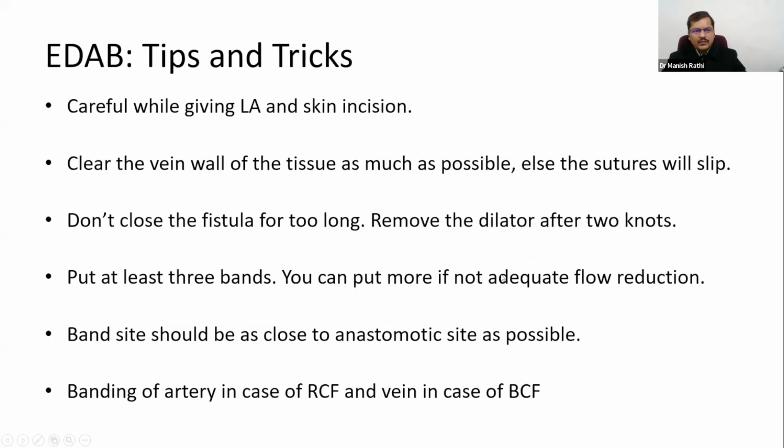So I would share some tips and tricks when you are starting this procedure. First, you have to be very careful in the beginning itself when you are giving local anesthesia and making the skin incision. Why? Because these veins are usually dilated. So what I do is pinch the skin and lift it up to give local anesthesia. Once I have given local anesthesia, I use toothed forceps to lift the skin and make an incision, because the vein is lying just beneath the skin and subcutaneous tissue. If you are not careful, you will injure the vein.